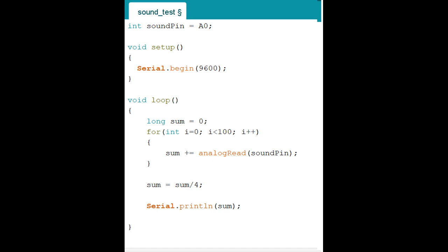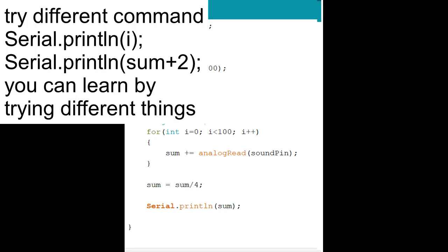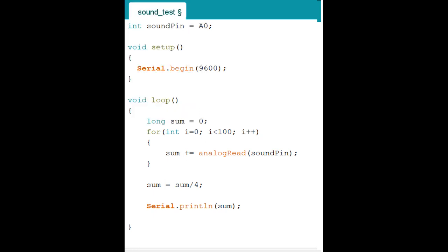Okay, and then enter, and then you assign print, right? You want to see the monitor, you want to plot, right? So capital S, Serial.println. That is telling the computer, hey, show me the numbers that you are getting, print out. So you're communicating to the computer, I want to see the number. Which number? I want to see the sum. So you put sum. If you want to see the direct input from A0, then you can put A0. Or if you want to do a different calculation, you can put it there. Then you close the parenthesis, semicolon and enter. Close the brace and you're done.